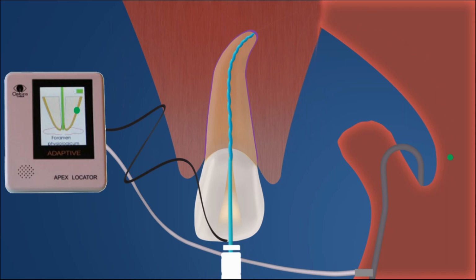Once the file comes in contact with the periodontal ligament, the impulse will start traveling through the oral tissues. This impulse is picked up by the lip clip, which is attached to the patient's lip, and will be carried back to the apex locator. These readings are processed using certain formulas by the apex locator and the reading will be displayed on the screen.